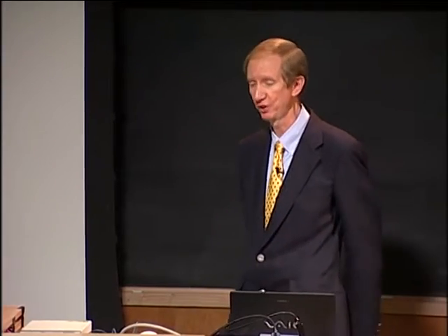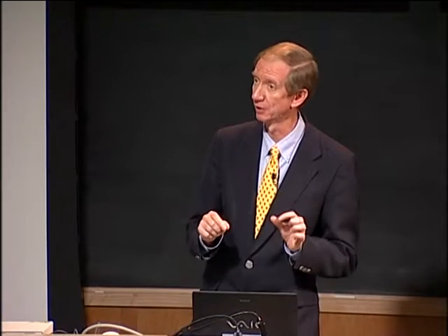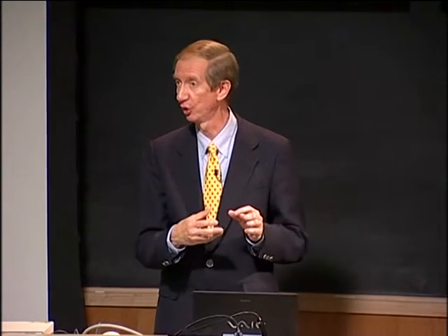So it's a good question. The question is, could we have a functional test for what the microparticles are doing in addition to just counting them? And the answer's yes. I didn't talk about that, but we've got a whole other side of the thing. So the thrombin generation assay is one form of functional test. If you actually spin these things out and wash them, like in an ultracentrifuge, and then you spike them back into plasma that's normal and shows no activation, you can show that these things are procoagulant by themselves.